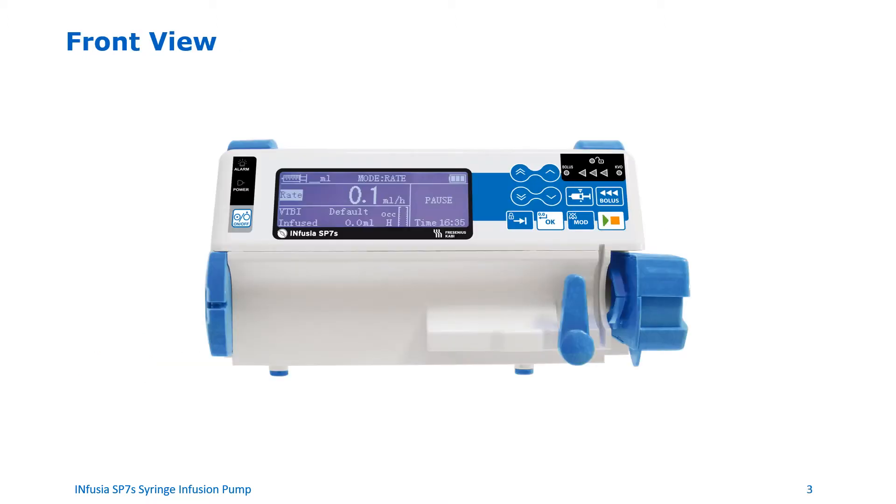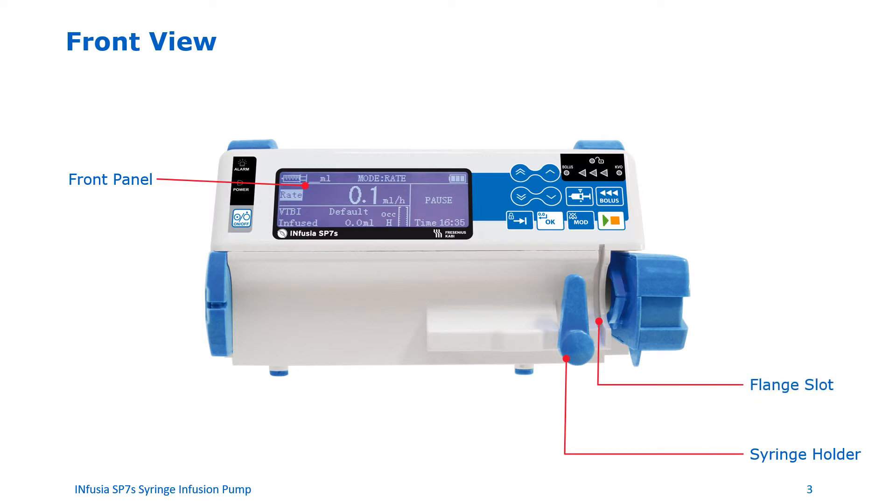Front view of the device. Let's familiarize ourselves with the front of the pump. The area of the pump with the screen and the keys is referred to as the front panel. The syringe holder holds the syringe in place. The flange slot is where the syringe flange is inserted. The plunger lock locks the plunger and pusher in place. The plunger detector detects the presence of the syringe and the size of the syringe.